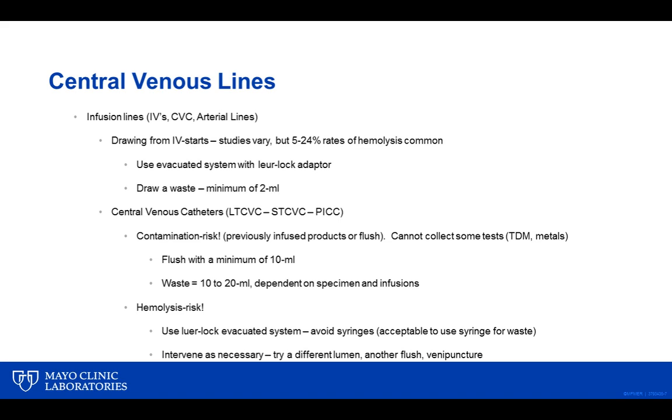When we look at indwelling catheters, central venous lines, long-terms, short-terms, PICCs, IVADs, we have a couple things that we're really concerned about. Number one is contamination, and that's typically due to previously infused products, whether they be fluids or medications.